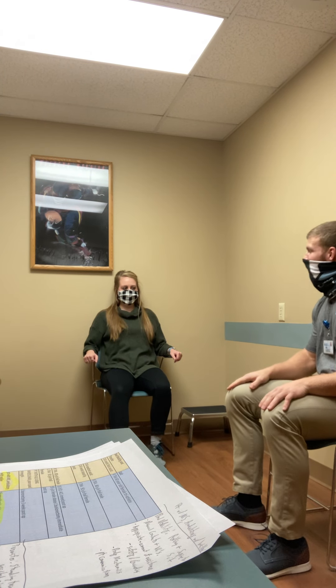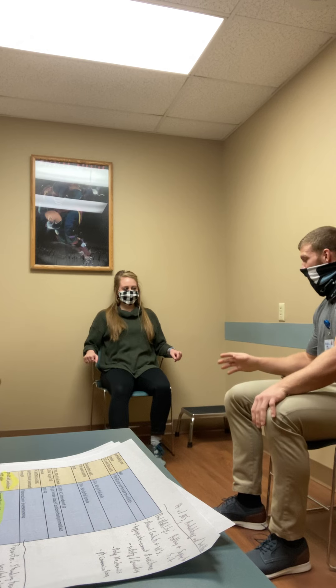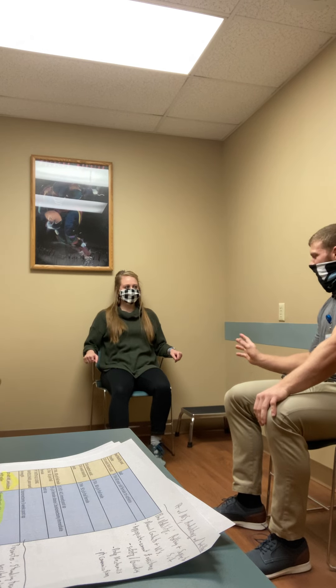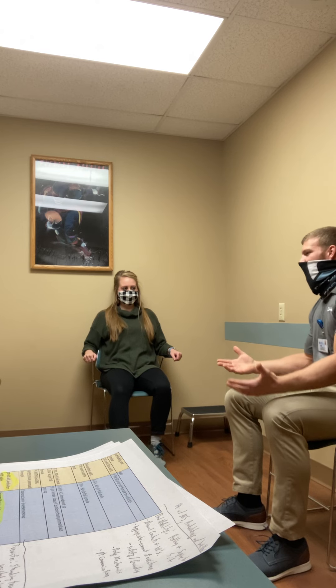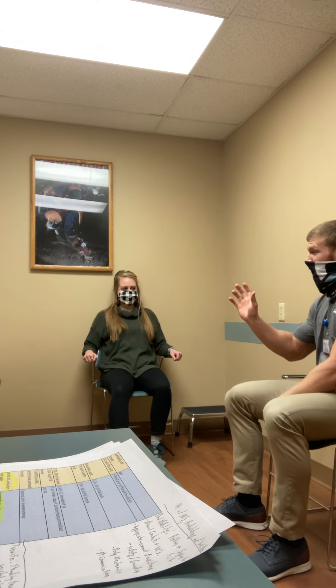All right, John, so you're coming here from the doctor's office. Looks like you sprained your ankle, right? Which ankle is it? The right one? Okay. So you want us to go over how to properly use crutches.